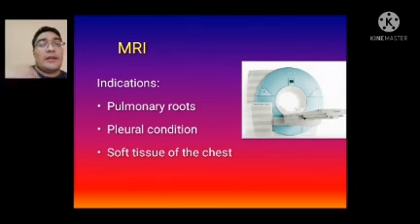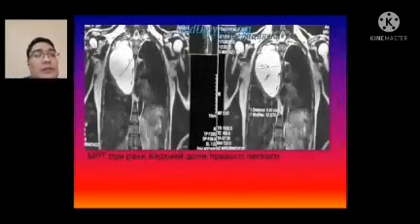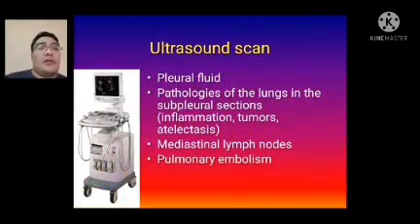This is the MRI. MRI is more clearly giving us information about soft tissue, but about the lungs, it's not so effective like CT scan. But if we don't have another choice, if the patient cannot take a high radiation dose, or maybe there is no CT scan near us, we can also use MRI as well. So these are the pictures, you can see them.